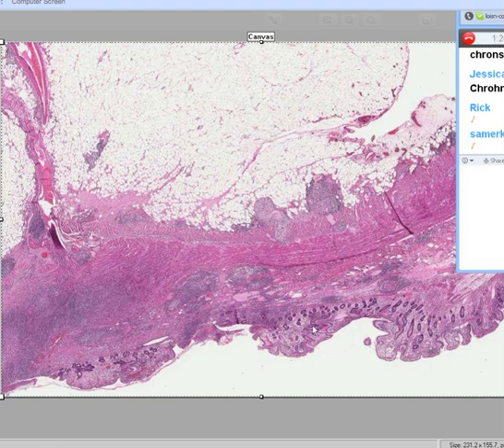Of course it's Crohn's. And now that you know that we said ulcerative colitis primarily is mucosal, but we said Crohn's is usually full thickness. And look, you even have infiltration through the smooth muscle over here. Can you see this here in the southwest? Can you see this pink thick band of smooth muscle being infiltrated by inflammatory cells? This is a full thickness disease. In other words, if the normal thickness of the small bowel is, let's say, 2 or 3 millimeters, this one could be easily twice as thick because of all the edema and infiltration and the thickening of the mucosa, and the infiltration of inflammatory cells in the submucosa and the muscularis.